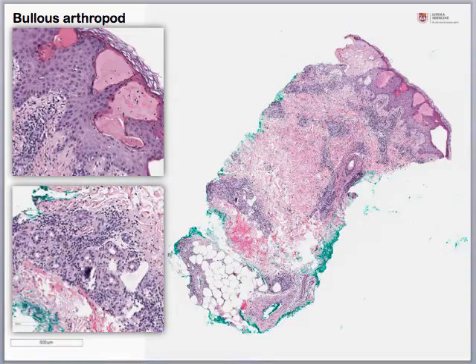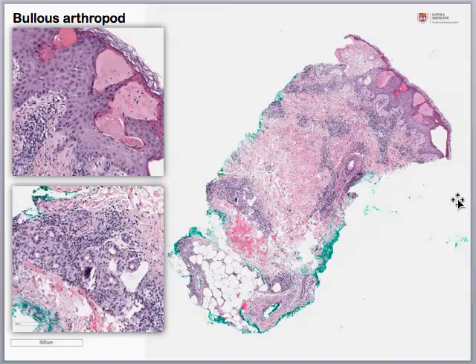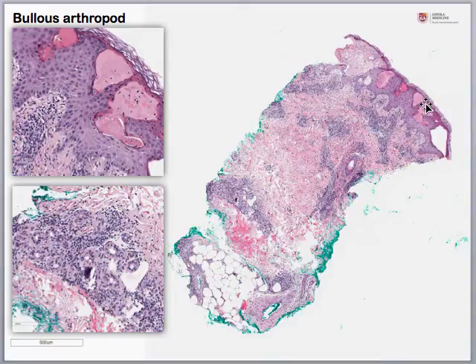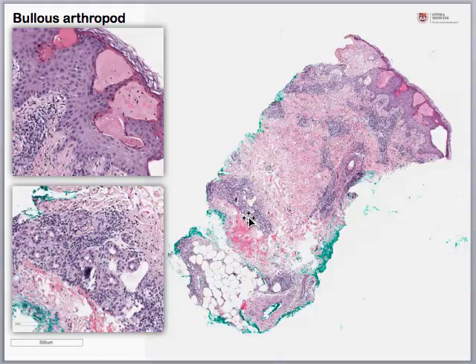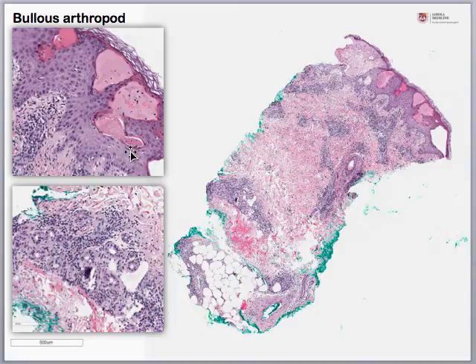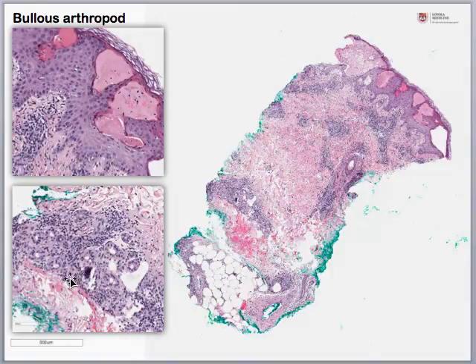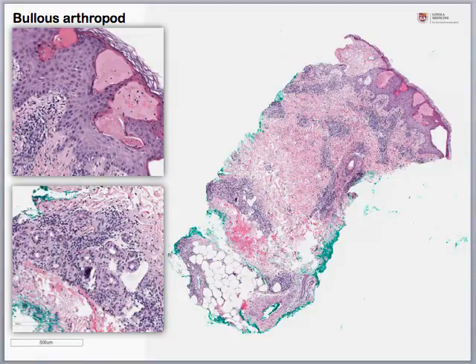Although this lesion isn't necessarily the first thing considered under the acantholytic differential, it is something that can look similar, so we wanted to include it. From low power view, we can see it's an intraepidermal process with serum deposition and a superficial and deep mixed inflammatory infiltrate — and this superficial and deep component is really the key take-home point. On high power view we can see the intraepidermal serum deposition, spongiosis, superficial dermal inflammation, and deep dermal inflammation, which is characteristic of a bullous arthropod reaction.